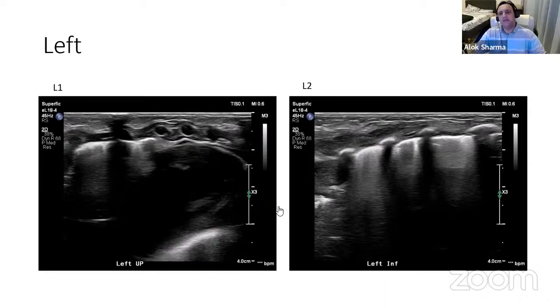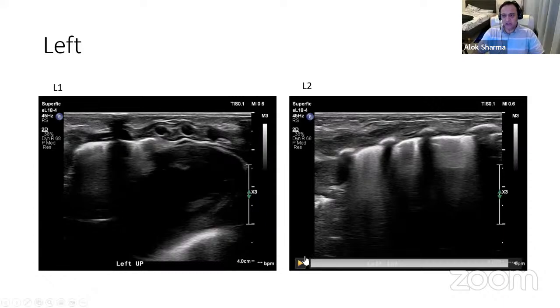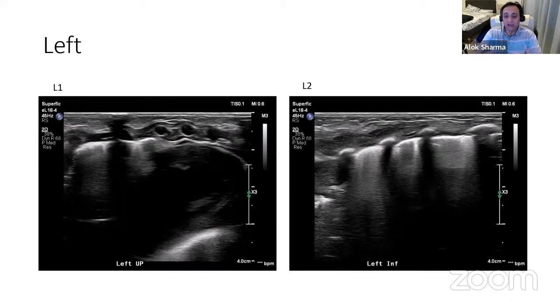So what I'd say is that lung recruitment reflects the ability to recruit lung that is either consolidated or atelectatic. The B profile and interstitial pattern of the lungs is because of fluid in the interlobular and intralobular spaces. Theoretically, there is a process, maybe mechanical, an obstruction by meconium, that's interfering with the absorption of that fluid. So for me, the B profile on its own is not a marker of lung recruitment. If I'm looking at a baby with meconium aspiration in particular, I'm clinically correlating.